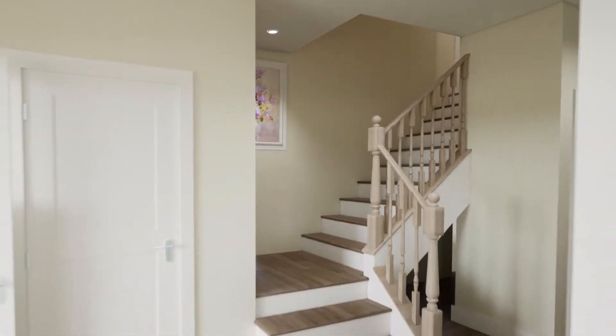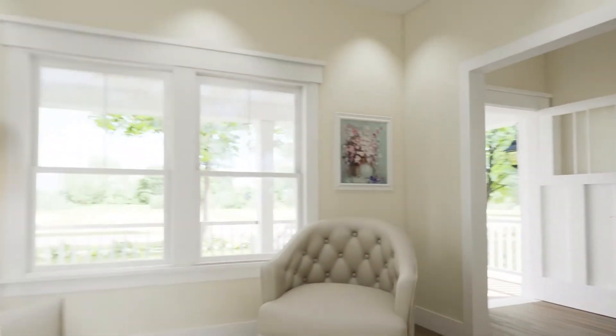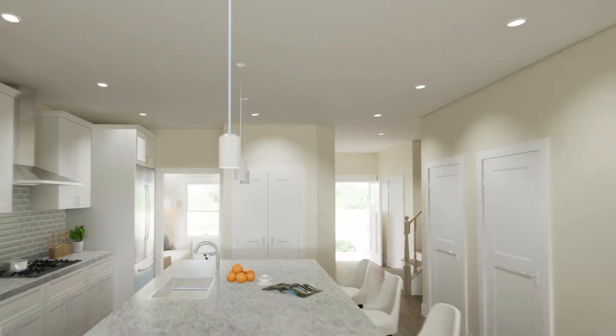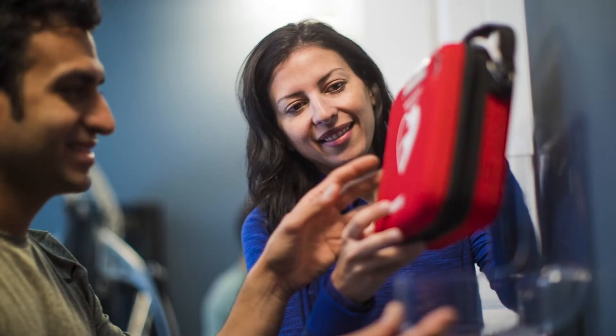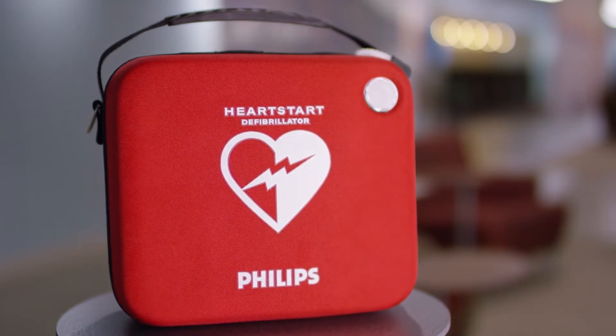Next, decide where to keep your HeartStart Home AED. Convenient areas to store it are often the family room, kitchen, or living room. It should be in a place where you can easily see and hear it, so you can check that the green ready light is blinking or hear alert sounds if there is a problem with the device.